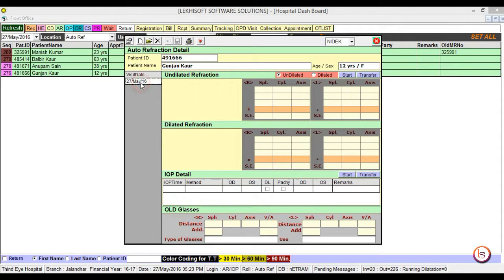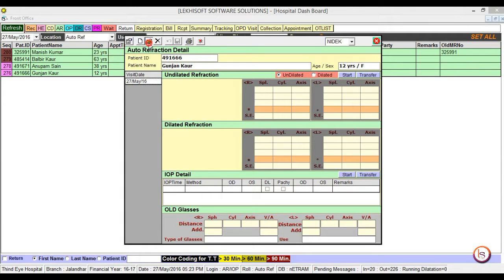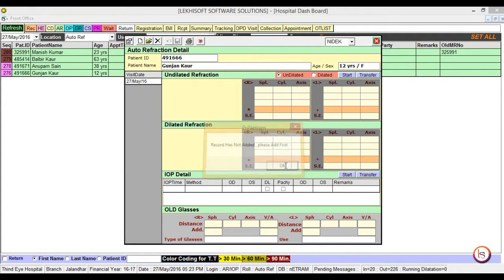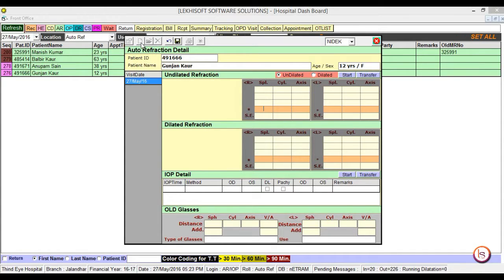Now select the visit date and click add. If you click on the modify button, it would display you a message stating record has not been added, please add first.